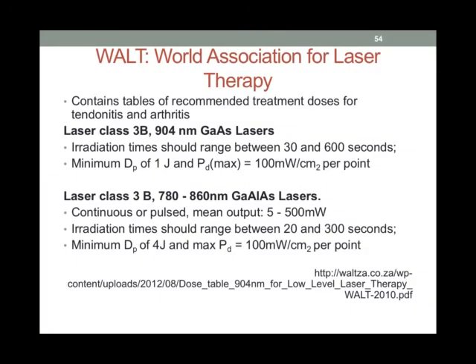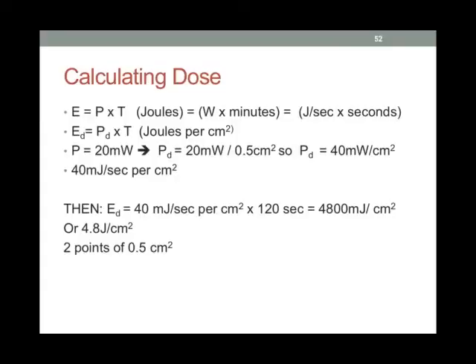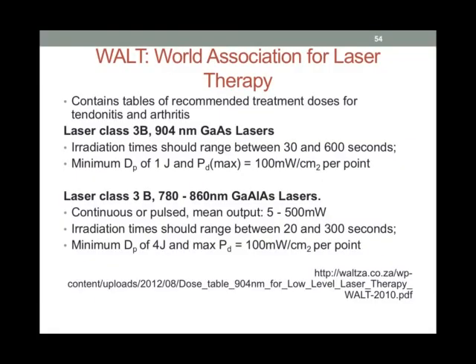All right, so how do we decide? Here we decided that with our 20 milliwatt laser, we were going to use it for 2 minutes. How do we decide that that's what we're going to do? There are two ways. There is a World Association for Laser Therapy, and they have come out with some guidelines. You have that in the references if you do want to have a look at it.